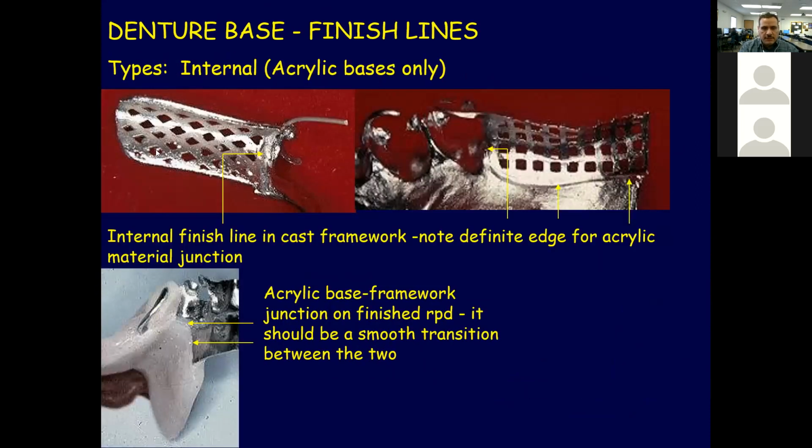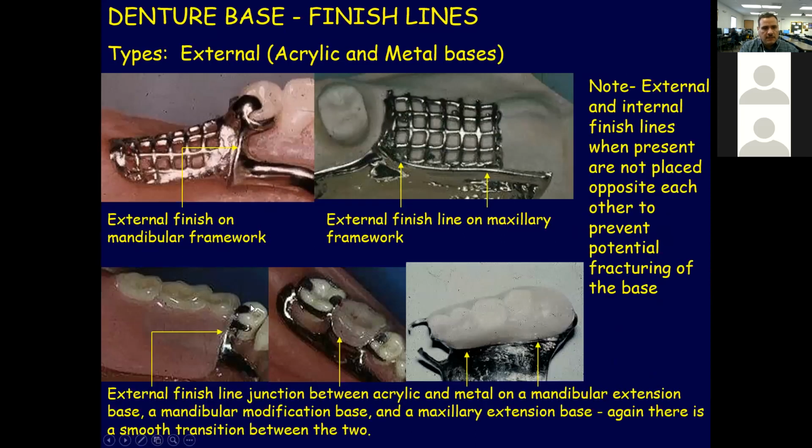This is the denture base. It will be a little rough, and the denture base should not touch the residual ridge, because there will be acrylic underneath and over it, and we could put the teeth over them.